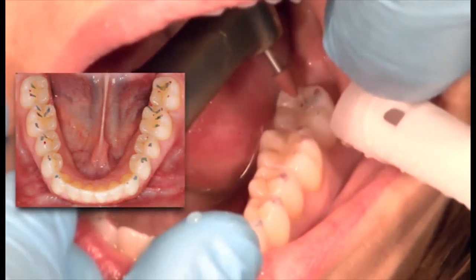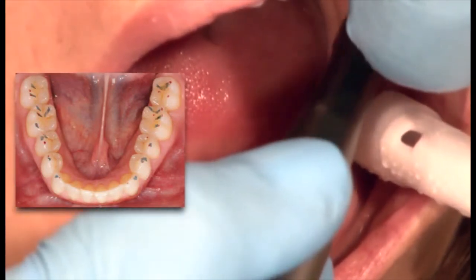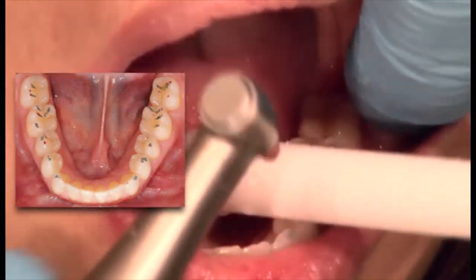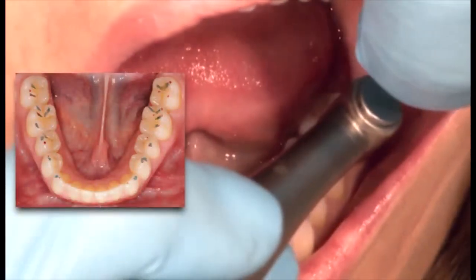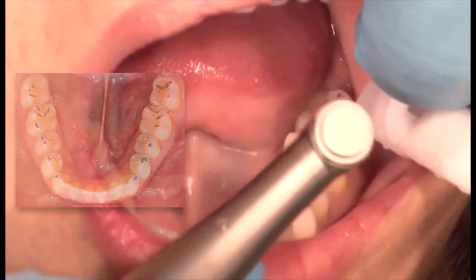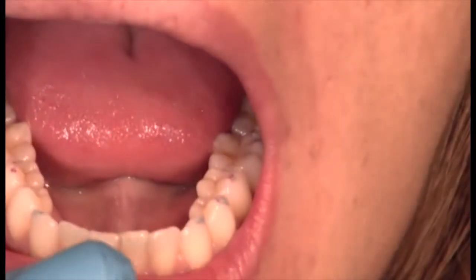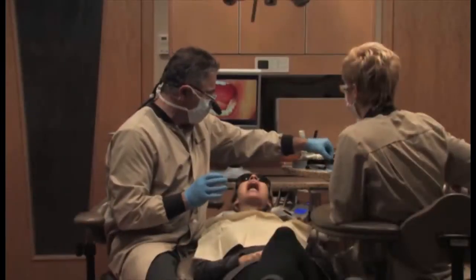This is that dangerous one that we talked about earlier, these inclines on these second molars that not only could deflect the jaw, but could actually create a concern if they were in slight pre-contact and the patient squeezes on those, they squeeze from there into the front teeth. So I haven't done anything to change the actual occlusion. I'm just reducing the chances of chewing interferences.